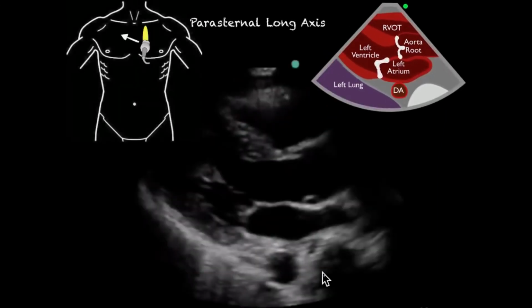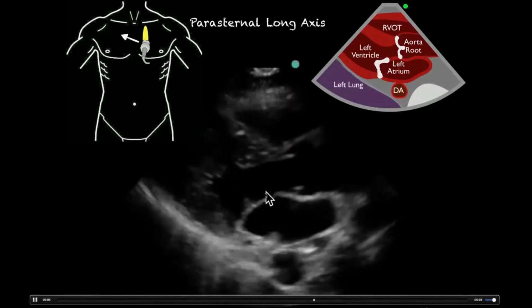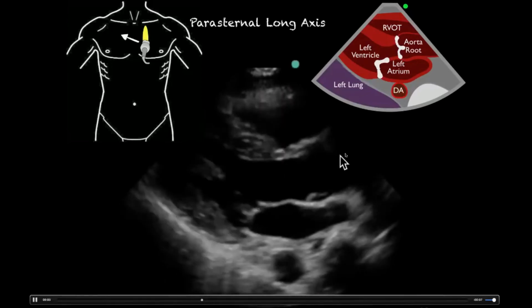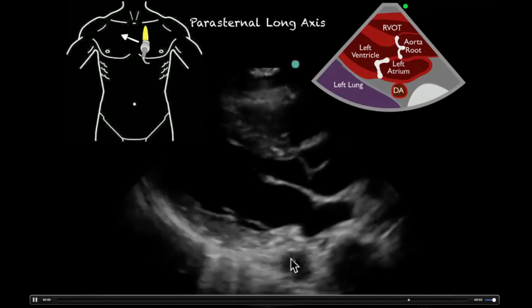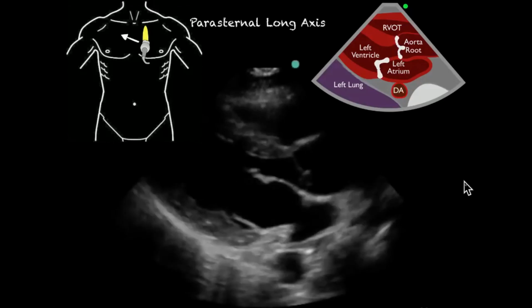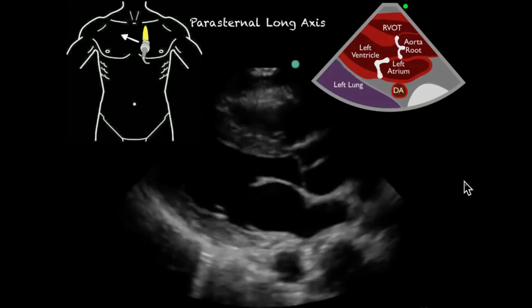So if we see a live film of this, this is what we see going on. We've got our big, thick, meaty ventricle here. Here's our mitral valve flapping into it. We see nice compression. This is collapsing well. We see that this outflow tract, or this is pointing away from it, this is the aortic root. So we have left atrium, and then we've got this descending aorta back here, and then we can remember our right ventricular outflow tract here. And I'll come off that just a second so you guys can see that well. But this is a normal functioning heart. If we apply those binary questions, this is a normal appearing heart here.